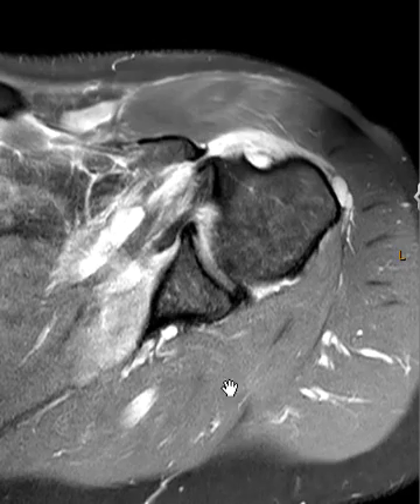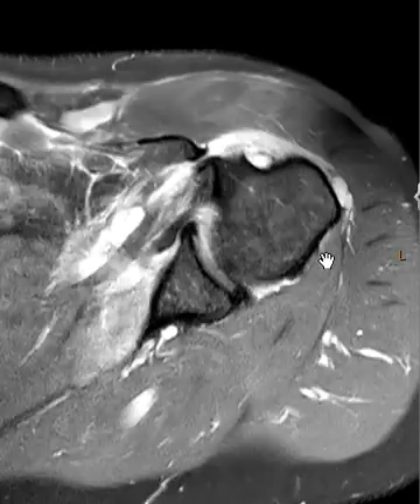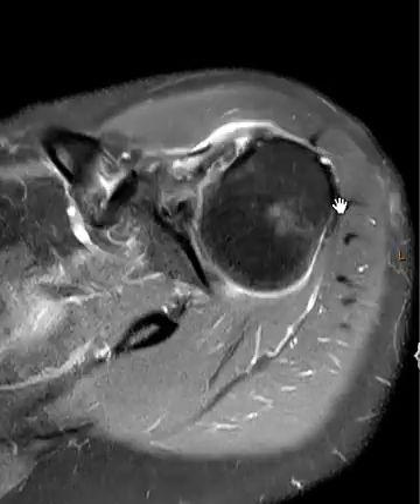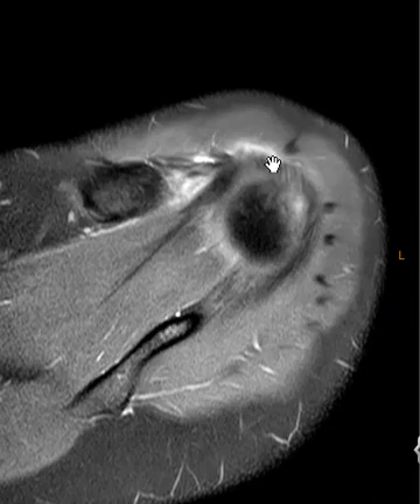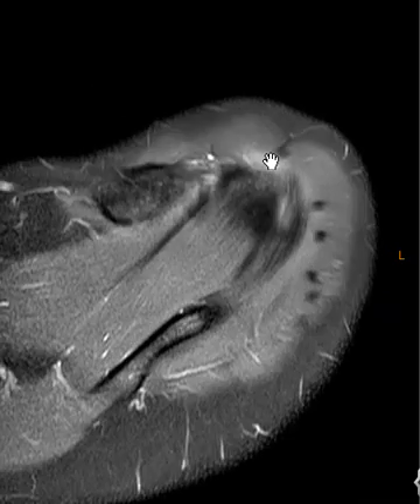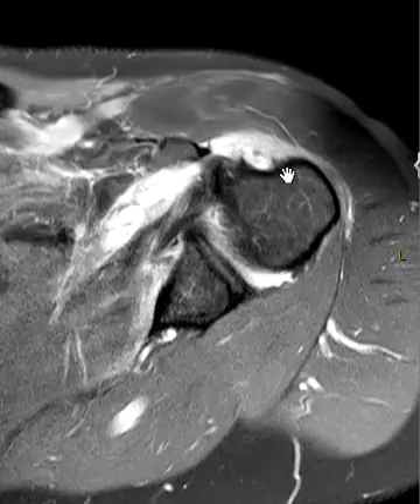Looking back here we see the posterior part of the rotator cuff — this is the teres minor muscle, looks good, and the infraspinatus we're getting into here looks good. The supraspinatus tendon is right here and it did have some partial tearing in the inferior attachment, but the main finding here is the subscapularis tendon.